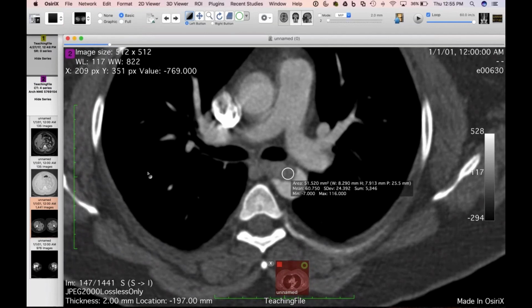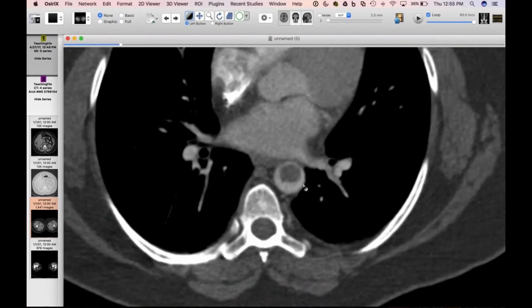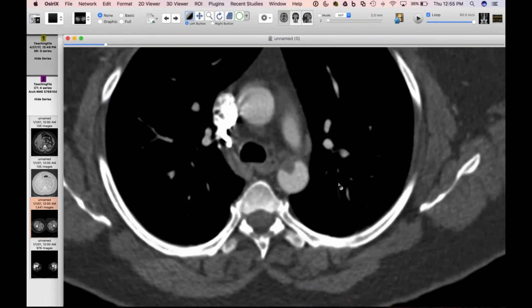And it persisted. They actually did a PET CT on this lady, if I remember correctly, just because they were worried about an aortic sarcoma. It was so large. And why do these things form? What was it about this lady that caused her aorta to thrombose like this?